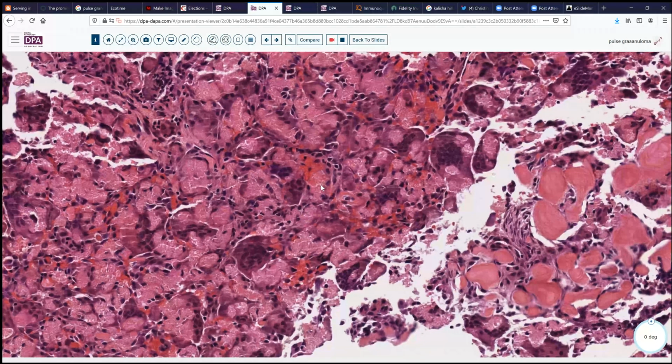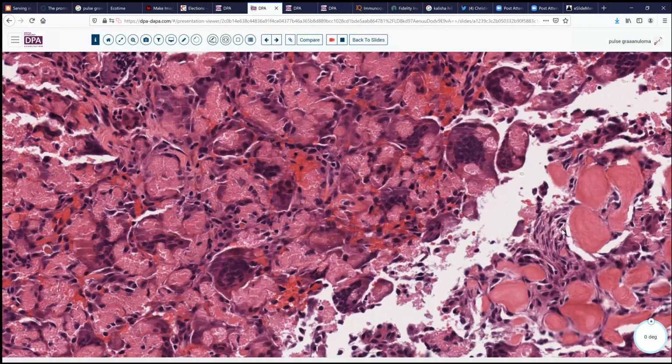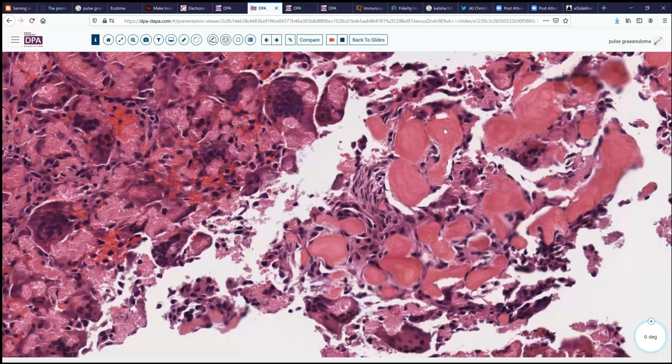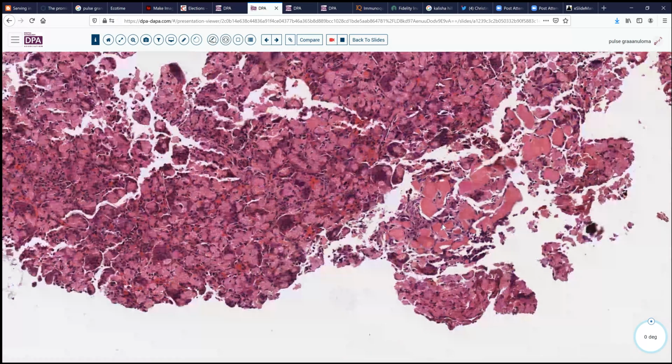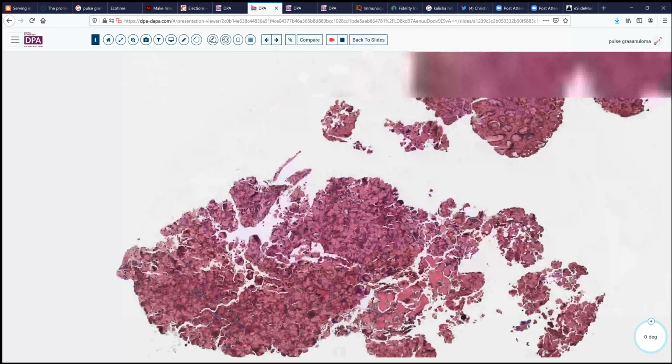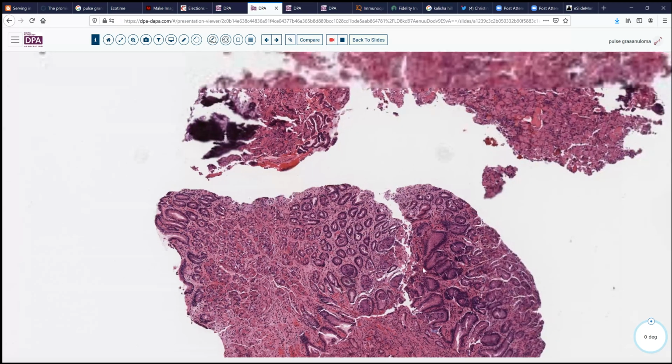So this is, rather than being a carcinoma or much less a GI stromal tumor, something that's characterized by a very abundant and exuberant foreign body giant cell reaction to this granular and in areas very eosinophilic and somewhat lamellated material. You can see there's little bits of lamellar ring-like structures to some of these here with different levels. We'll take a look at some of the other fragments as well to give you a feel for the spectrum of problems that are here.